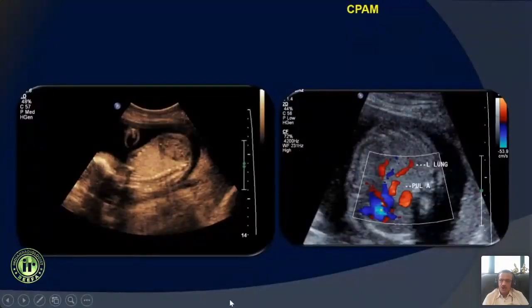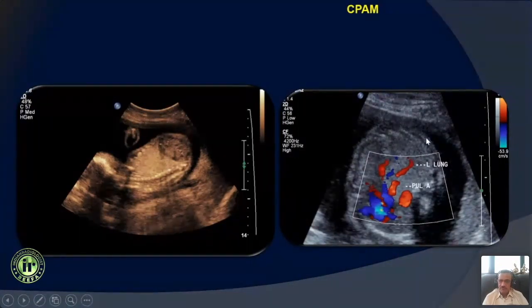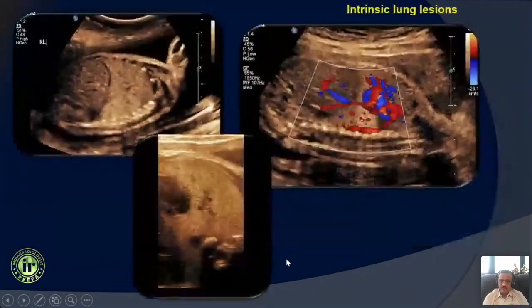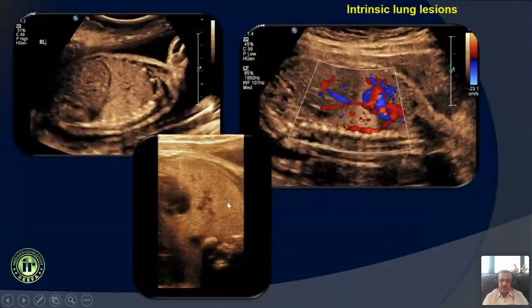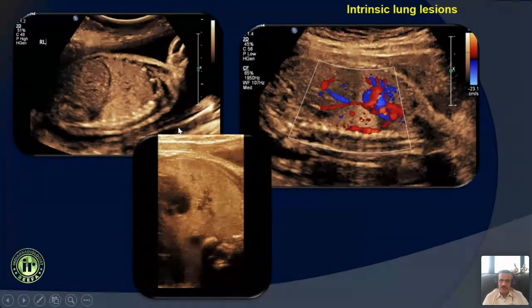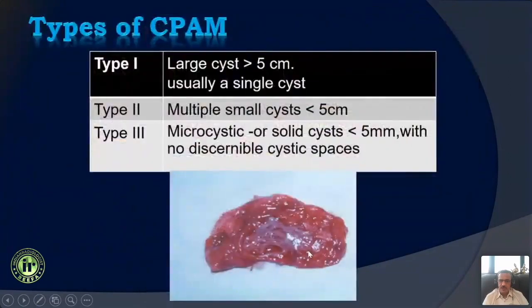The diagnostic feature of CPAM is that the blood flow comes from the pulmonary artery and venous drainage also is from the pulmonary veins. So whenever we see masses like this — here for example, filling up an entire lung — it is very important to look at the blood flow.